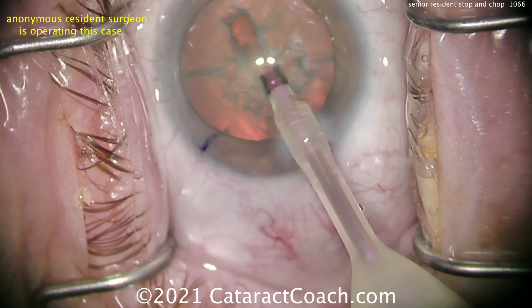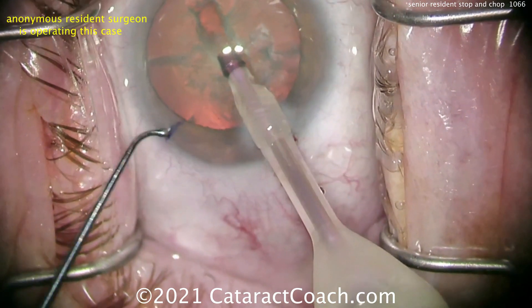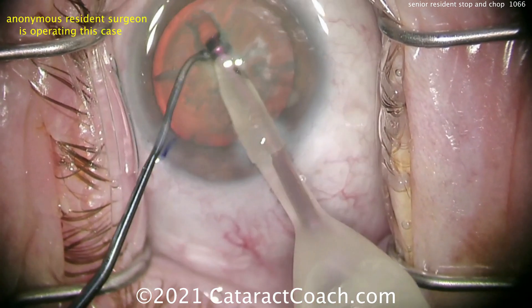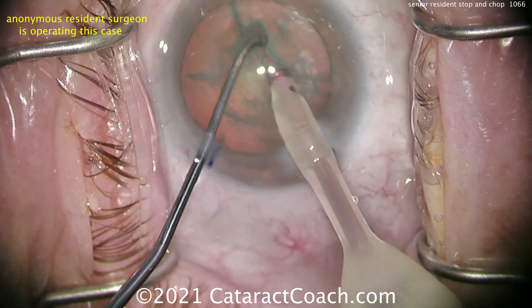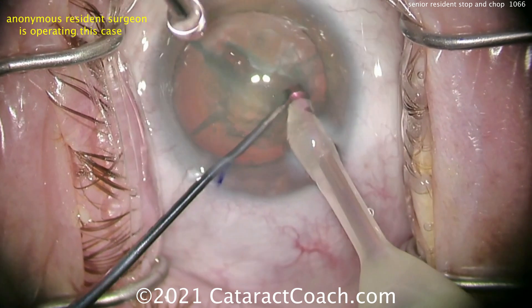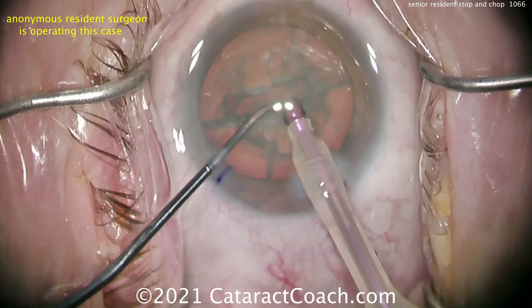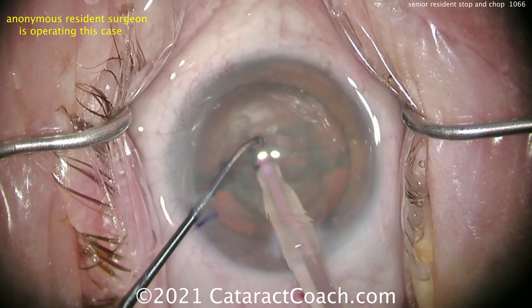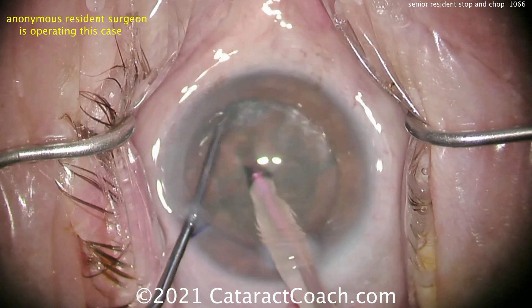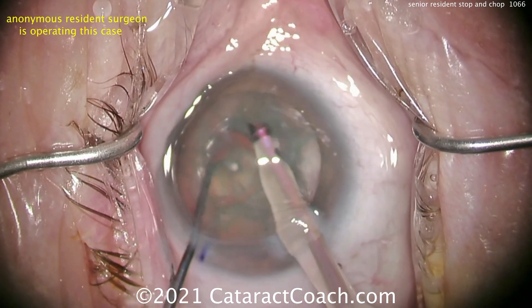I'm curious to see what the second instrument will be — is it going to be a chopper of some design, or a spatula? It's a ball-tipped chopper. That'll work fine. Splitting the nucleus here, cracking it — now distally, now centrally, and now sub-incisionally. Very nice job. Let's see the stop and chop. The chopper goes around, and there's the chopper. Good job.